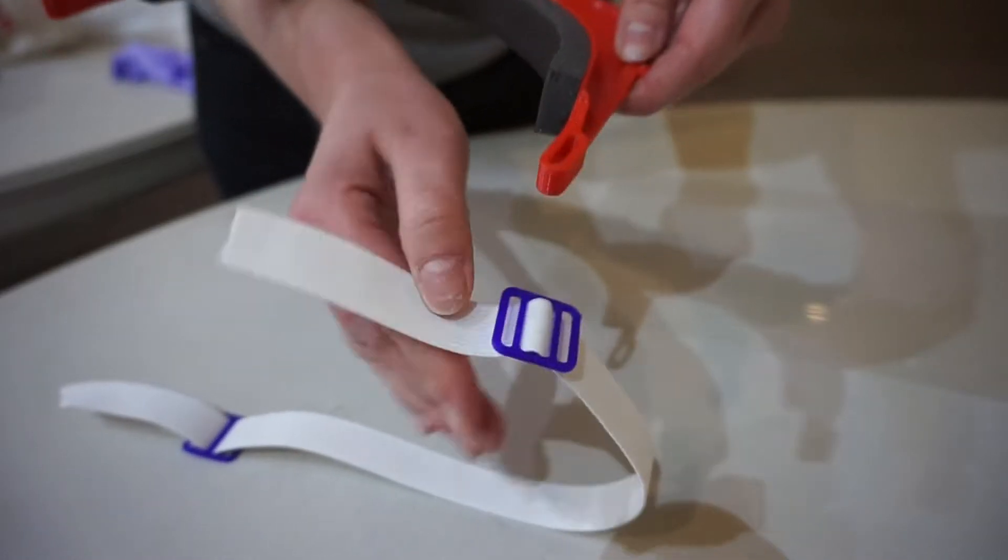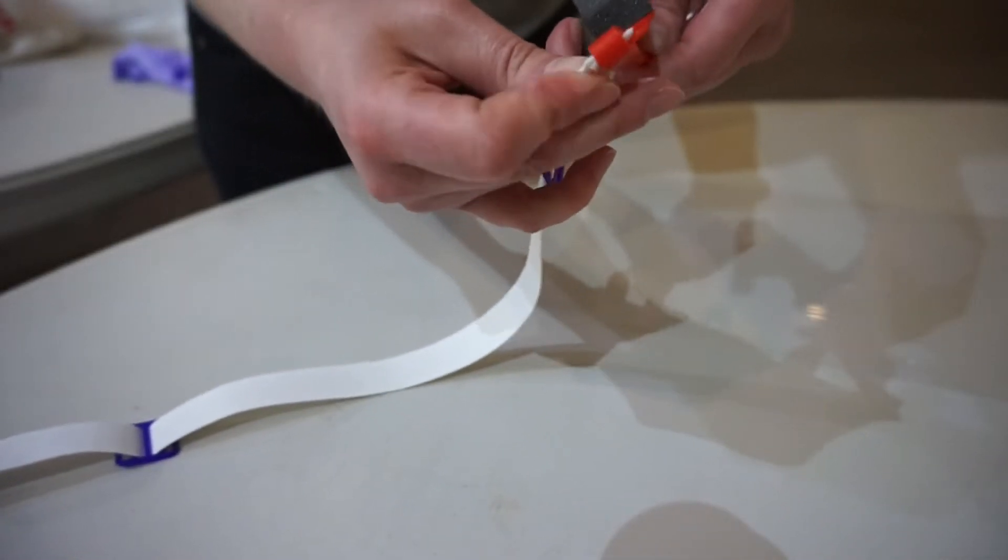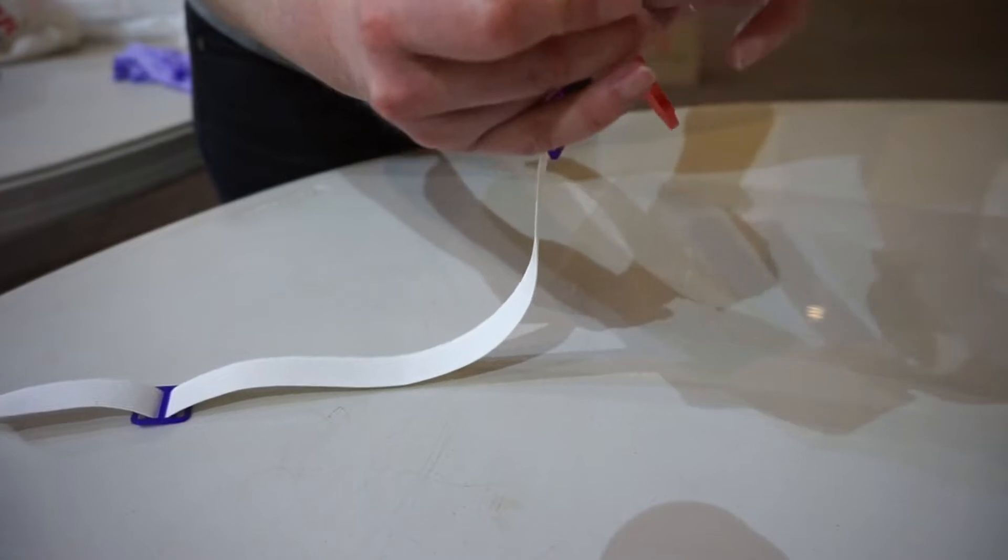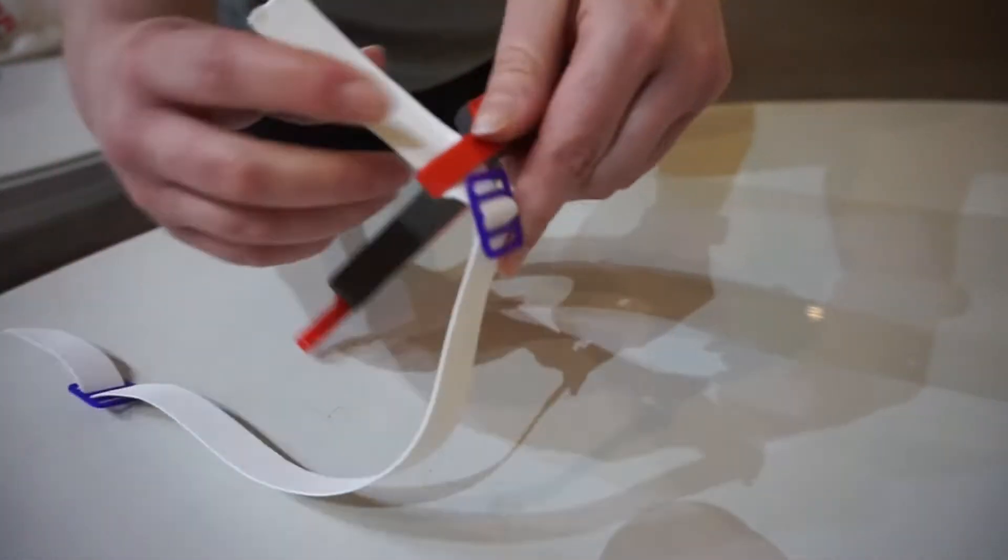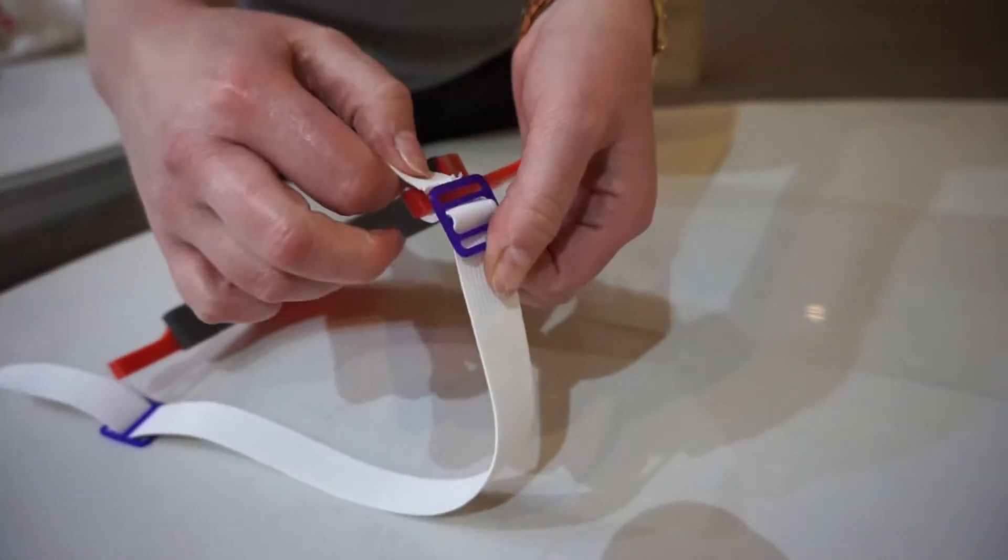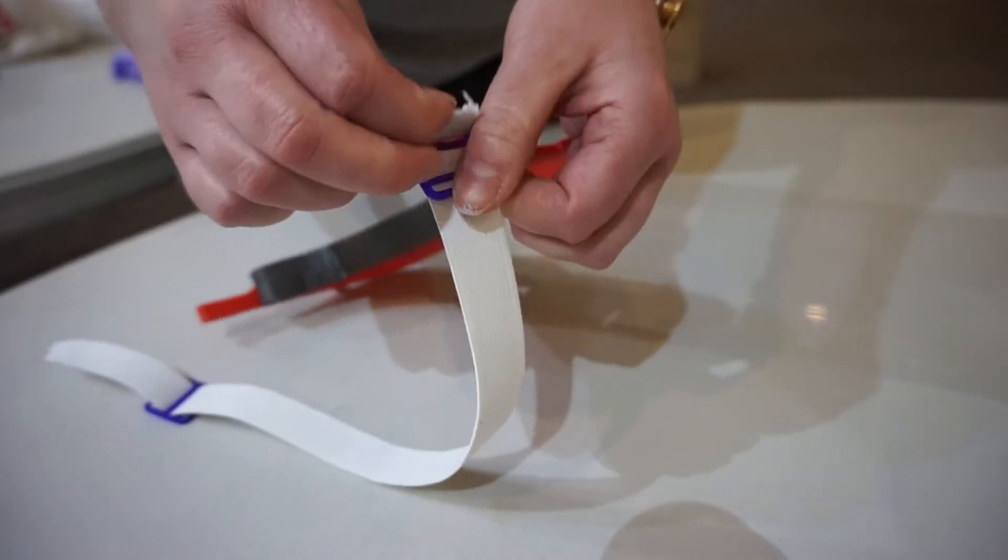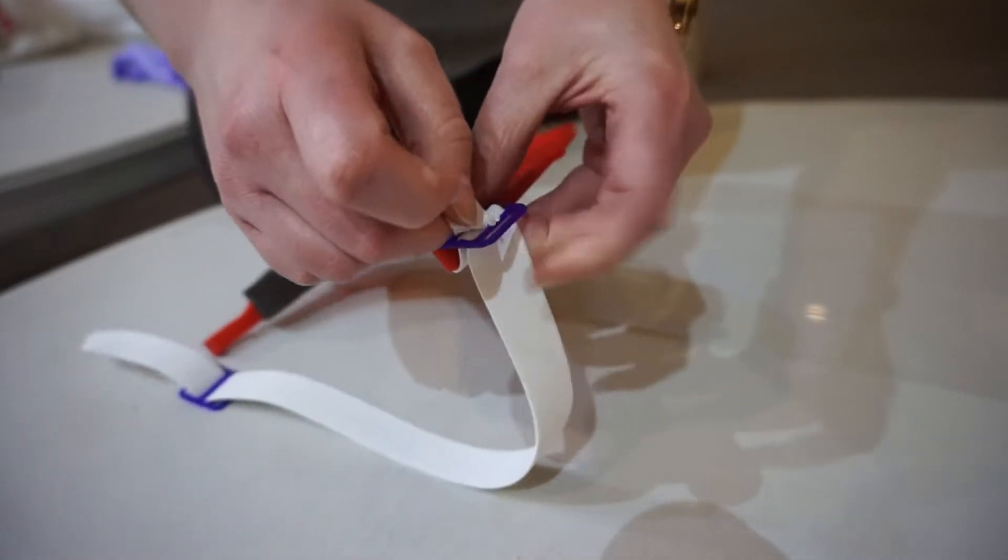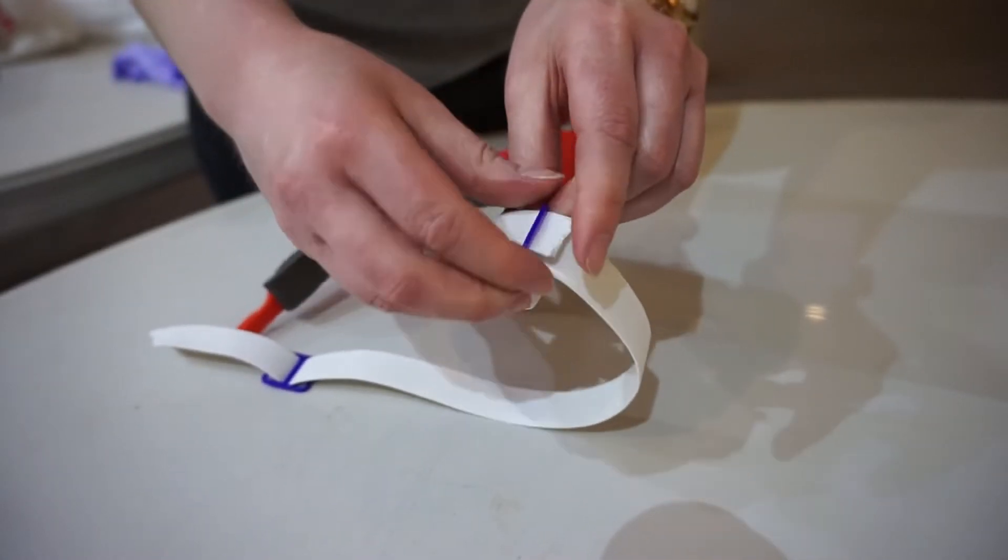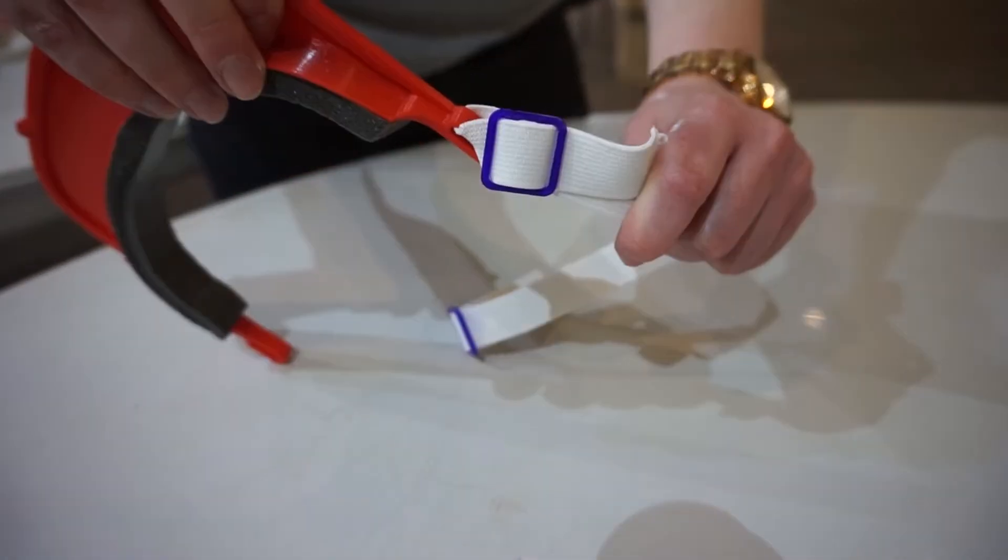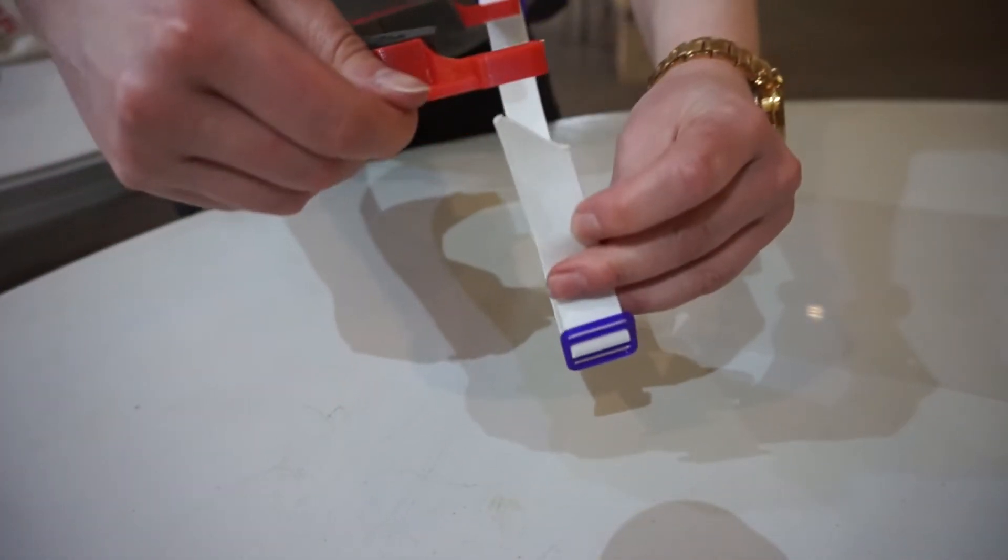To attach to the visor, hold the elastic and strap lock as shown and insert from the bottom side of the visor. Bring it back down the outside and feed as shown into the outer two holes. Repeat on the other side.